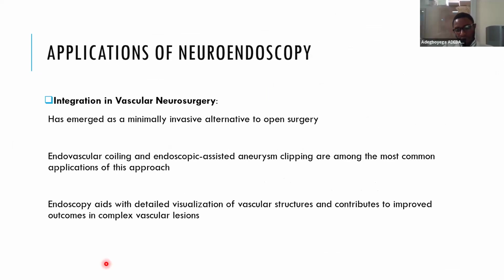The integration of the endoscopic approach into vascular neurosurgery has emerged as a minimally invasive alternative to traditional open surgery. It has been used in endovascular coiling and aneurysm clipping. Endoscopic visualization aids with detailed visualization of vascular structures and minimizes complications.